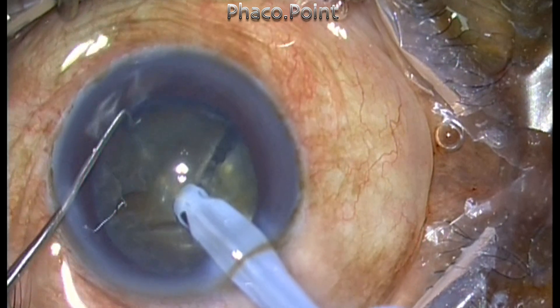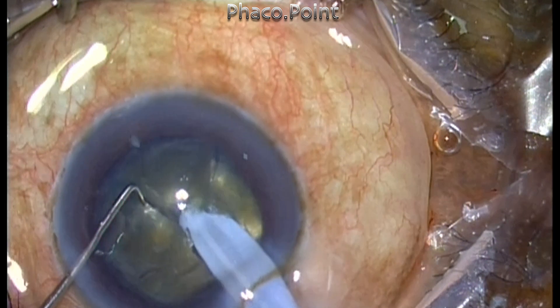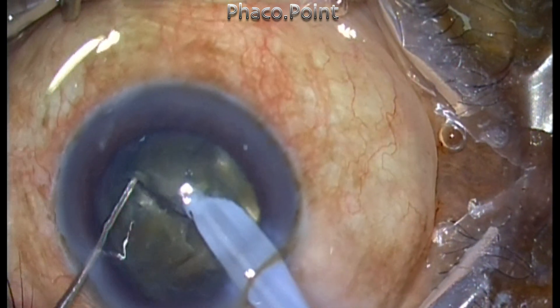If you have an attachment while you try to mobilize the nucleus fragment, the entire remaining portion of the nucleus will follow behind it, and this will create a problem.